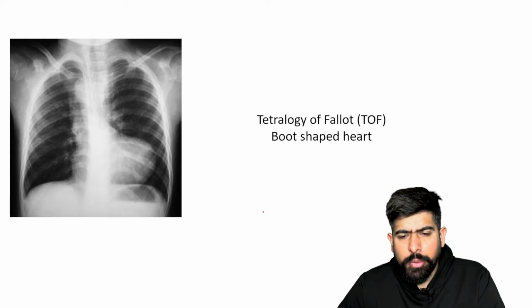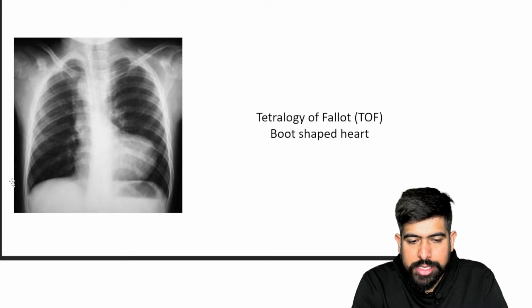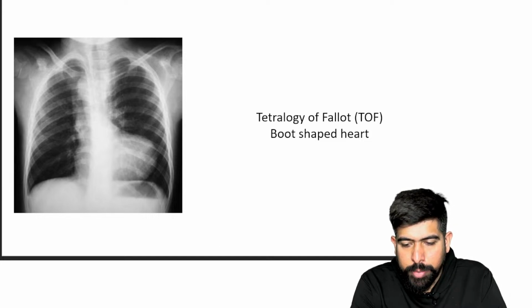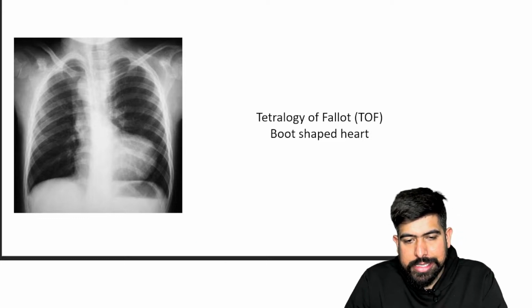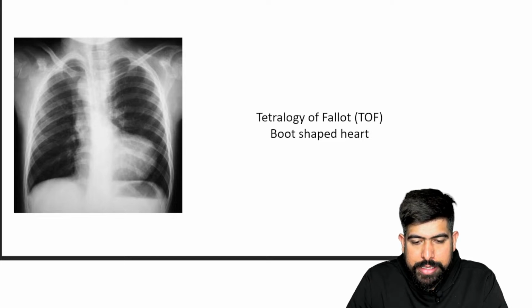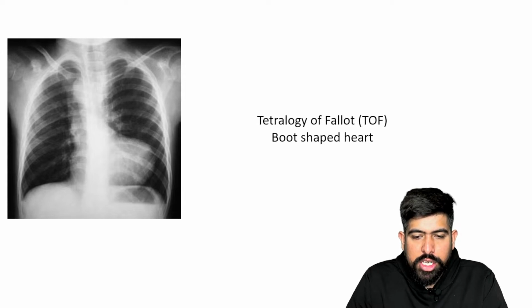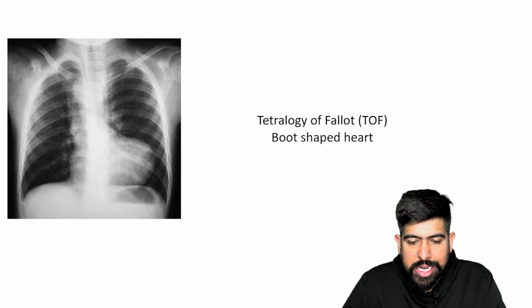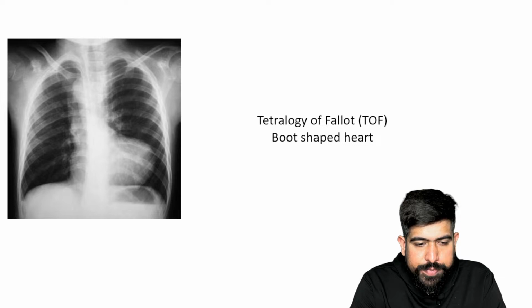Now, moving forward to the next one, which is your tetralogy of Fallot, and I hope you know about this tetralogy of Fallot very well. What is this? Yes, this is the boot shape sign, the boot shape heart. I'm going to show you one more image for the same condition. We have two images.